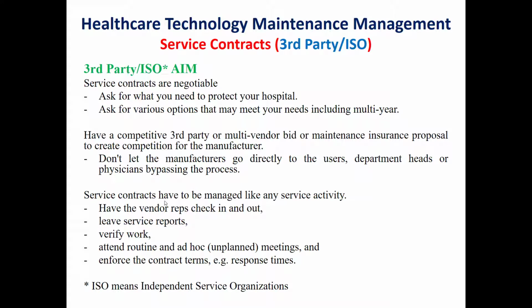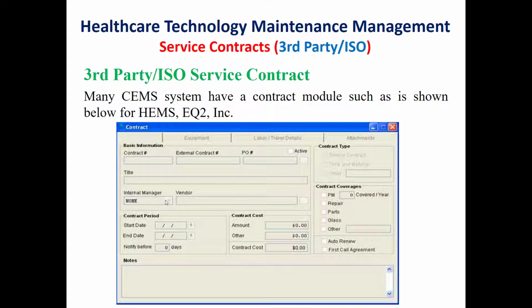The service contracts have to be managed like any service activity. Have the vendor representative check in and check out, leave service reports, verify the work which is performed by the vendor, attend routine and ad hoc meetings, and finally enforce the contract terms, for example the response times. Usually in computerized equipment management systems, we have a contract module to manage such type of contracts.